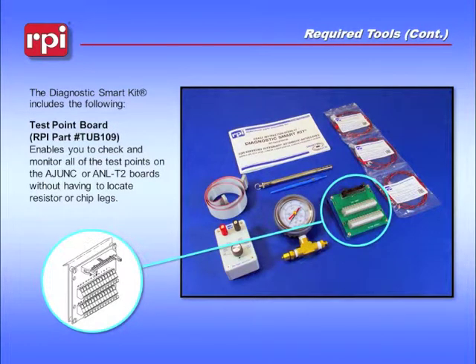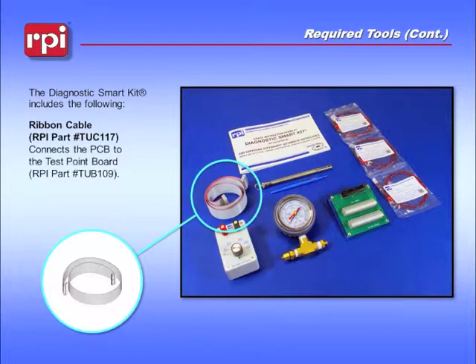Some of the components inside the Diagnostic Smart Kit include the Test Point Board, RPI Part Number TUB109, which enables you to check and monitor all of the test points on the Adjunct and ANL-T2 boards without having to locate resistor or chip legs. The ribbon cable, RPI Part Number TUC117, allows you to connect the Test Point Board to your Adjunct-3 board.